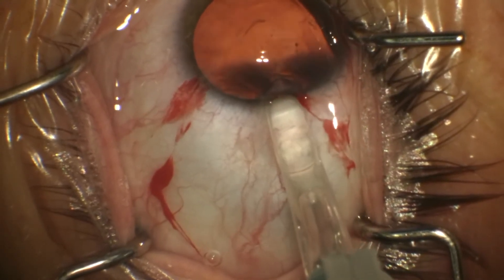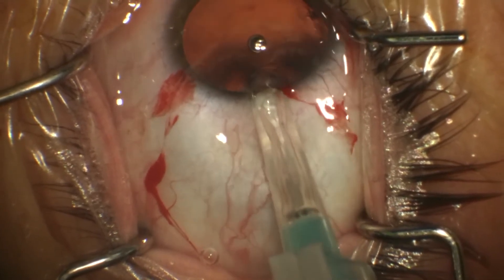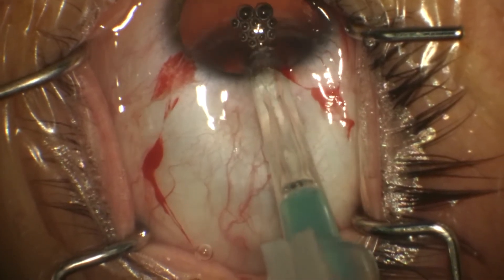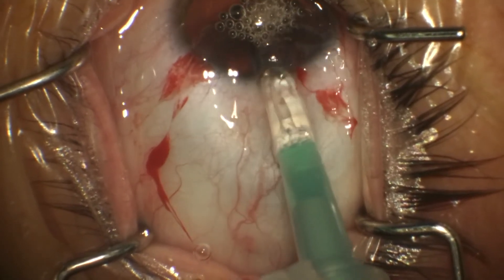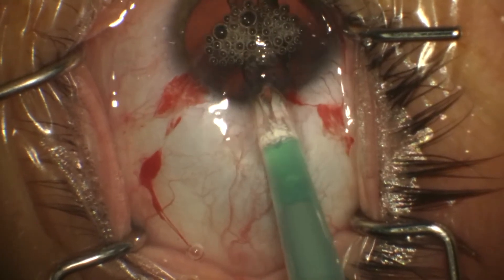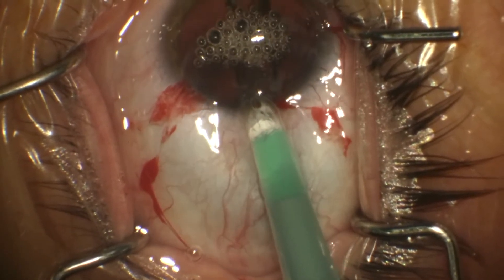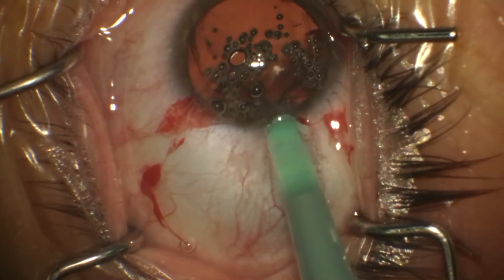You can see it does not get caught in the folding mechanism, which is really important to watch under direct visualization so you don't catch the ICL there. Injecting it in the eye is simple. It's hard to get all the air out — there's probably a good way to do that — but the bubbles are inconsequential to the outcome of the surgery. The ICL goes in very easily. I go slow just to make sure it folds properly and is not upside down.